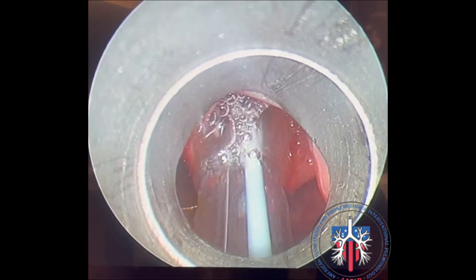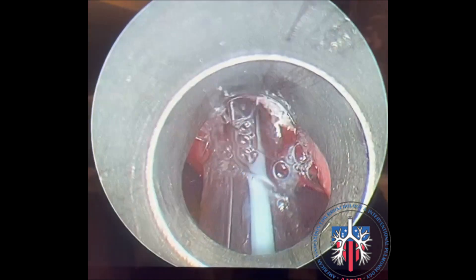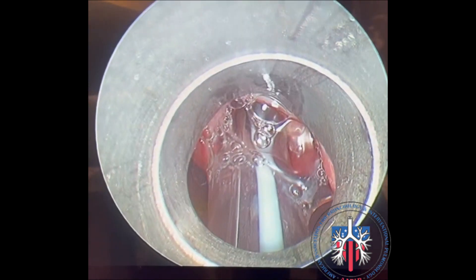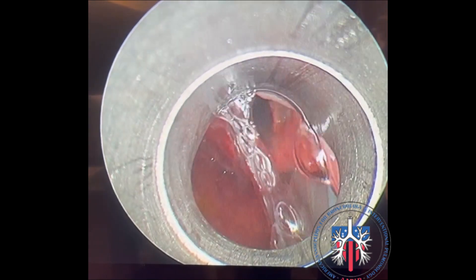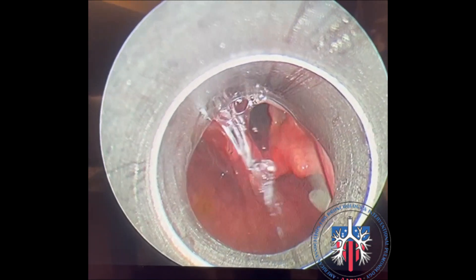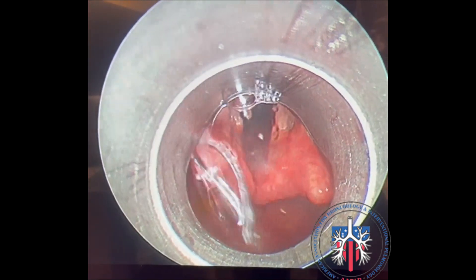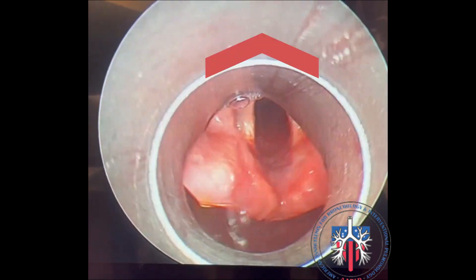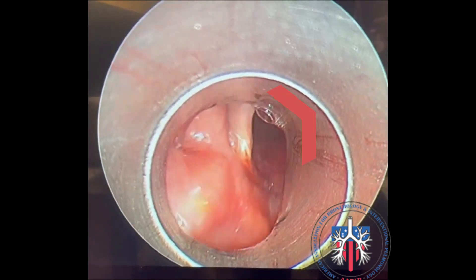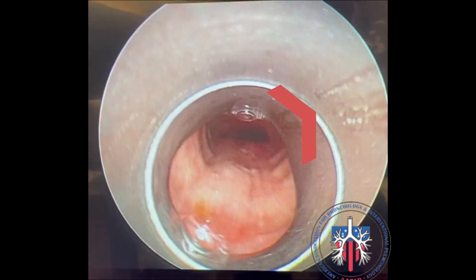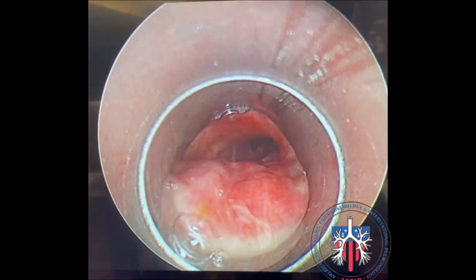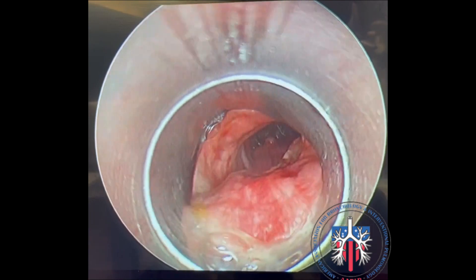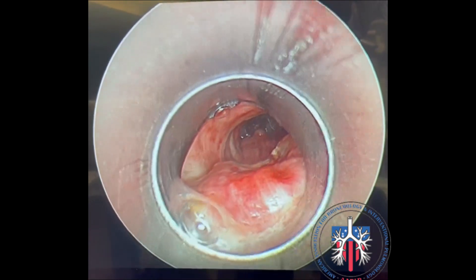Deflate the tube cuff and remove the tube rapidly. Intubate the trachea in the standard fashion by rotating the bevel of the scope 90 degrees to enter the trachea. Establish ventilation.